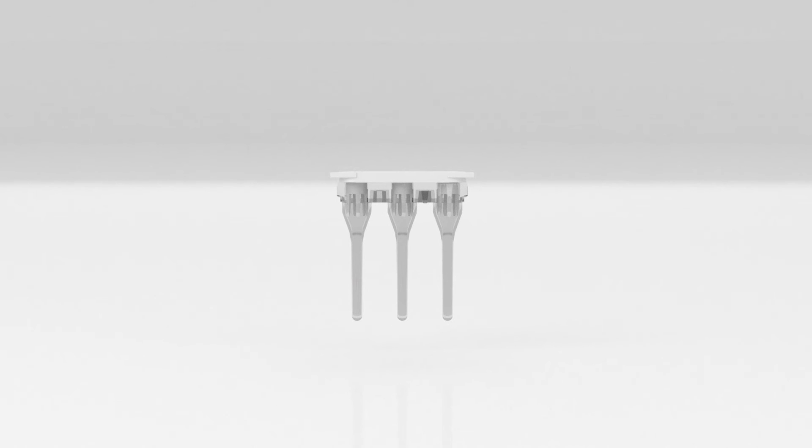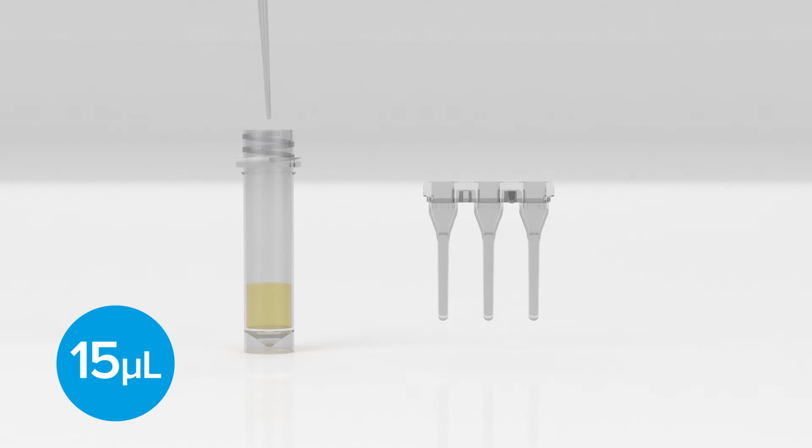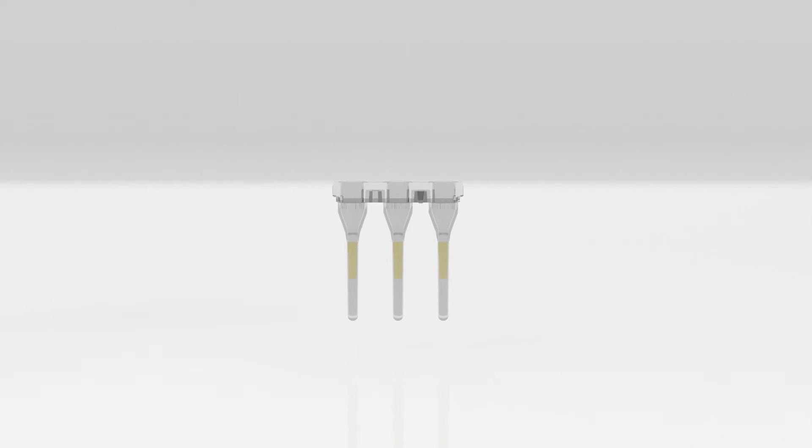Remove the plasma preparation cartridge from its foil pouch. You will notice crystals in each channel — these crystals contain protease and buffer. Remove the bung from the cartridge and immediately add 15 microlitres of the diluted plasma sample to the centre of each channel of the cartridge. Next, label the GeneDrive cartridge lid with the sample or patient identification number and attach it to the cartridge.